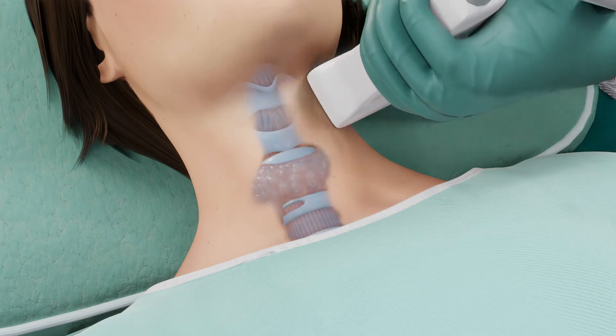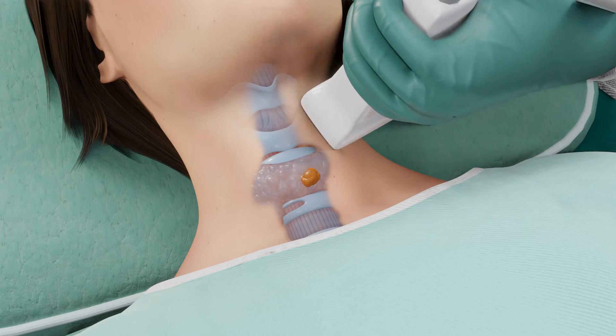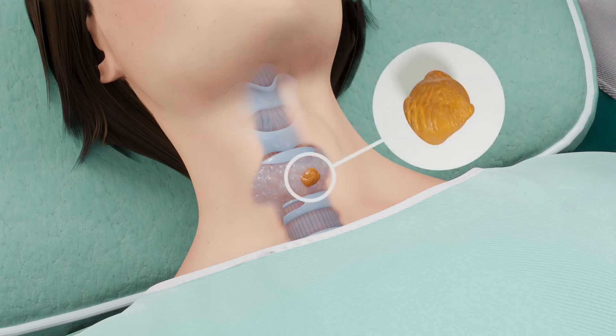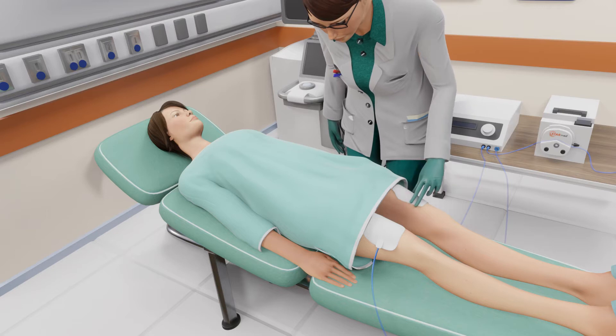Before the procedure, your thyroid is examined with ultrasound imaging to locate and measure the dimensions of your thyroid nodule. Preparation for the StarMed Thyroid RFA procedure is now ready to begin.